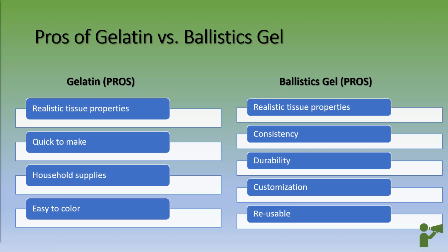Yeah, I am a big proponent of using ballistic gel. I've actually never used anything else. One of my mentors had used ballistic gel, so that's what I've always used. And she had taught me to add other raw materials like glass microspheres and stearine and other things that you can just get at the craft store to adjust the tissue properties to make it look like various things in the human body. So I've had a lot of fun playing with that. Way too many hours spent over a crock pot on my free weekends for sure.